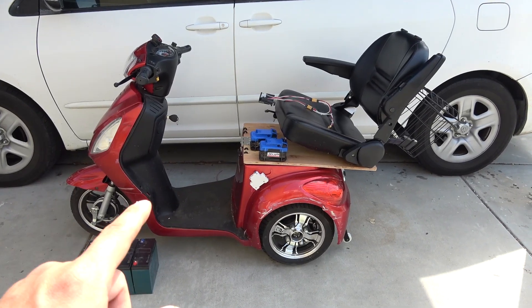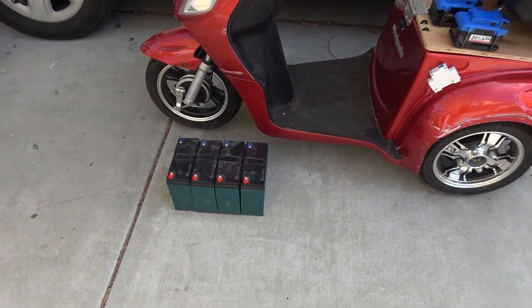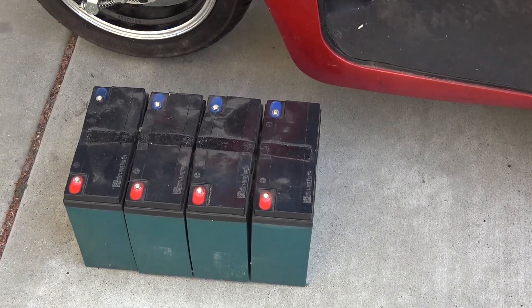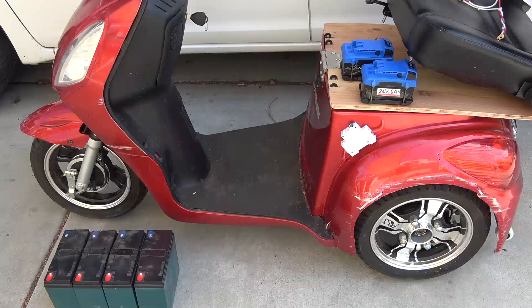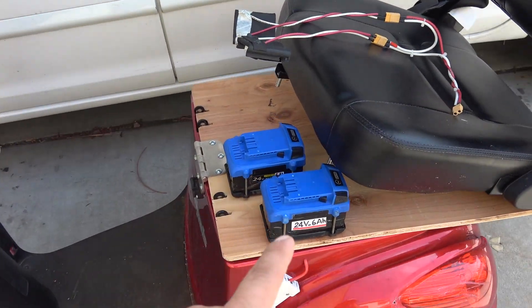Today I have an eWheel 48 volt mobility scooter. This scooter runs on a 48 volt lead-acid battery pack — four 12 volt lead-acid batteries connected in series — and it is swollen up pretty bad and does not hold the charge anymore. So today I'm going to go ahead and replace the lead-acid battery with my two 24 volt Power2 batteries.